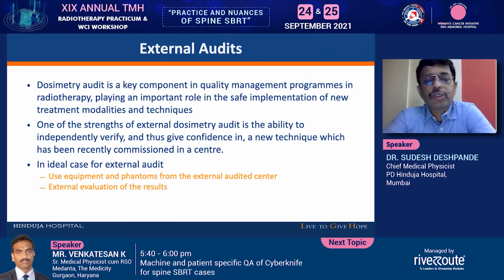It may be possible that you have some chamber which has a wrong calibration factor, and you are commissioning with this chamber, so you will not get any error. But if you use a different chamber, you can find out the error. The same applies to the external evaluation of the result.